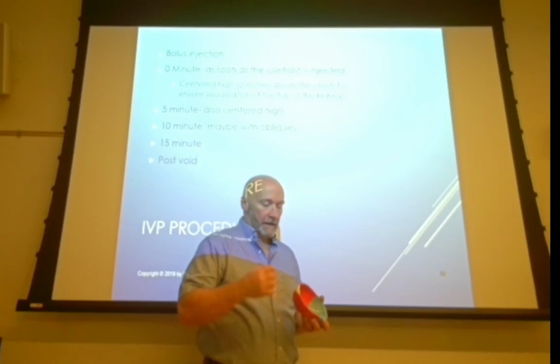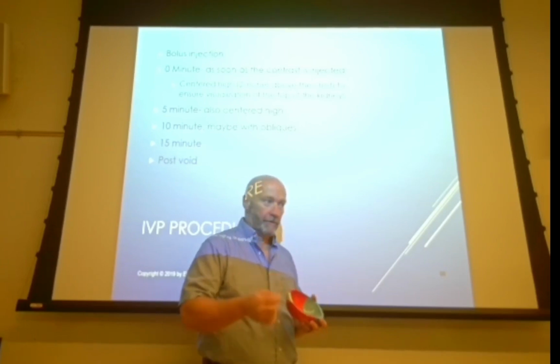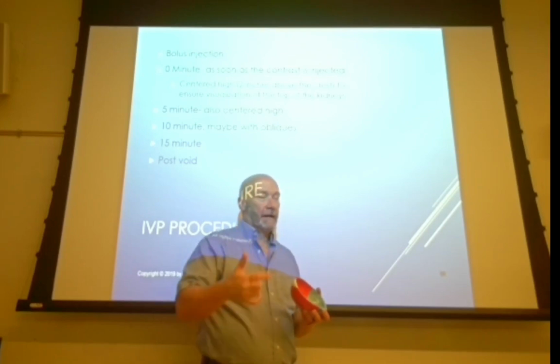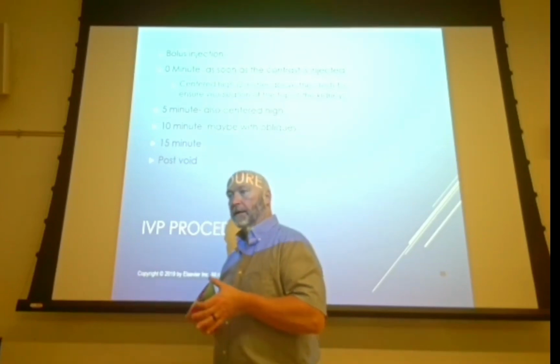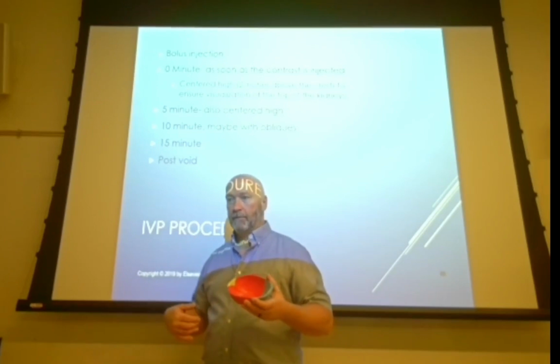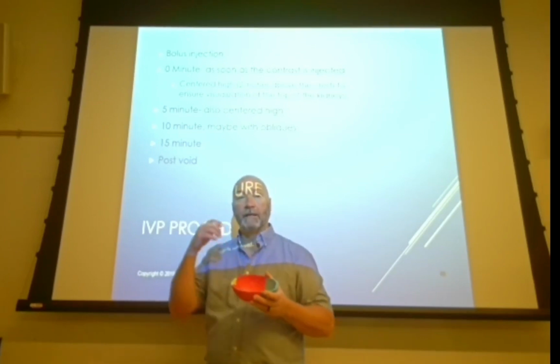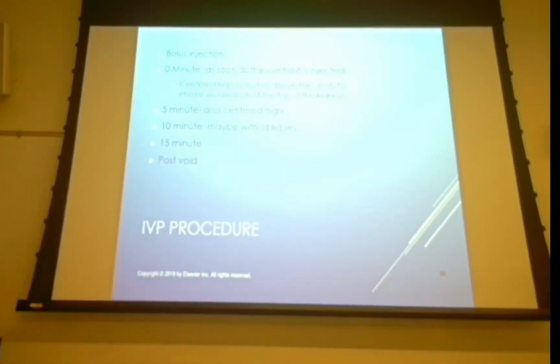Yeah. So in a lot of cases where your stones are going to hang is all the way down at the ureteral orifice, okay? So not only are you going to see good AP and lateral of the kidneys, but you're also going to see the ureteral insertion on the elevated side. So in two views, you get AP and lateral of both kidneys and both ureteral insertions in the bladder. So make sure that you get as much of the kidney as possible and then down to the ureteral insertion.